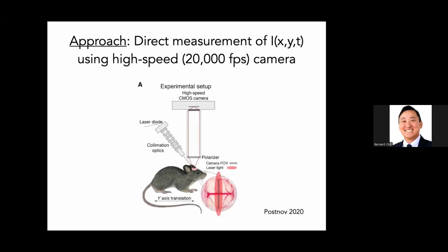So this is now basically doing imaging. This is trying to do imaging more like DCS, diffuse correlation spectroscopy, where you do laser illumination at one point, and then take measurements really fast. You're trying to image or measure the correlation function directly. You're trying to measure G2 directly. In this case, we're trying to do the same thing, just in an imaging modality. So we have, I don't know, let's say 3 million pixels, doing 3 million basically DCS measurements.